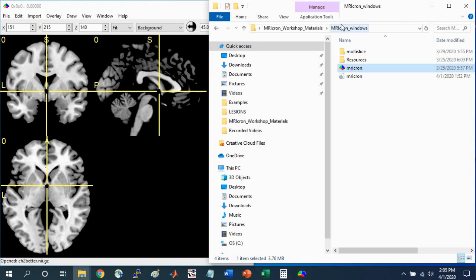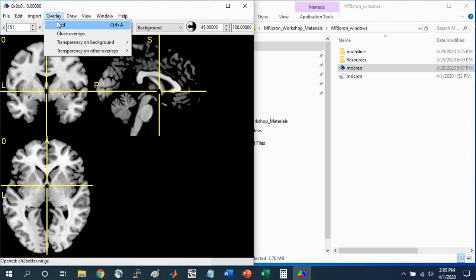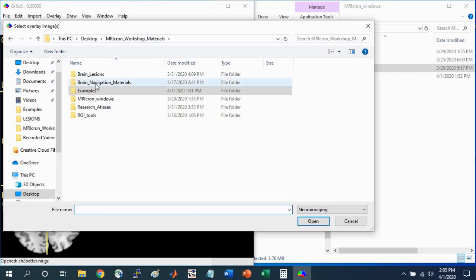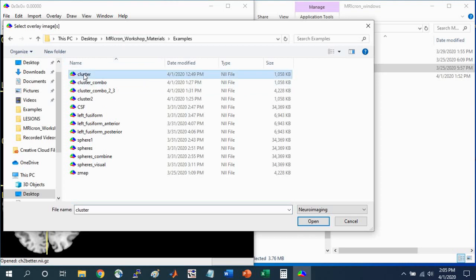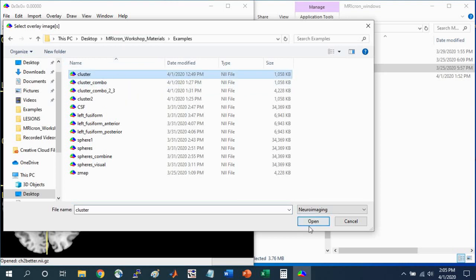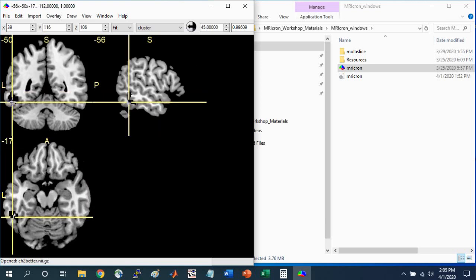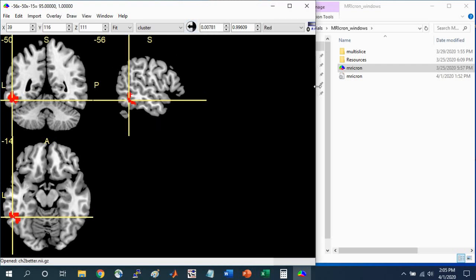The first thing I want to do is overlay a functional cluster on top of this standard brain. Go to Overlay, Add, and within the Examples folder, I'm going to select this cluster file right here. This is just a functional cluster that I've identified as an example. We can left click on the Auto Contrast button to see this cluster more clearly.